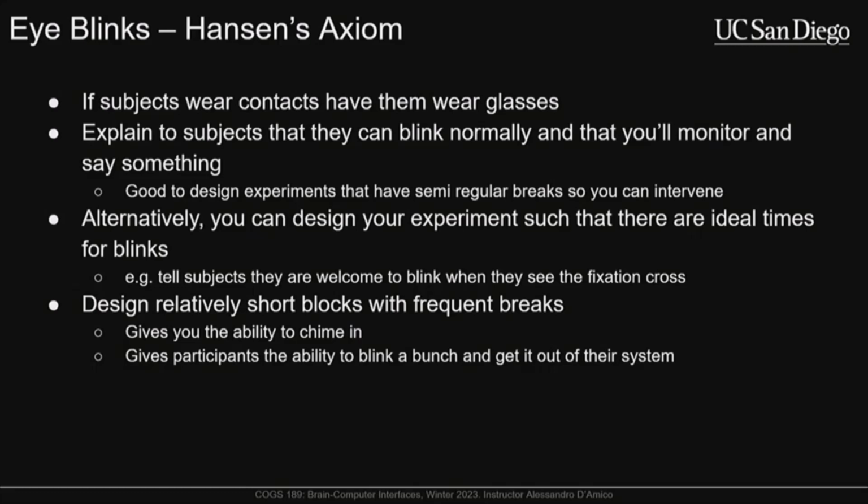That is the biggest reason, but also sometimes I'm just paranoid that there's some kind of metal in them or something that would be problematic with recording. Yeah, I think the metal is less of a problem, but most glasses are plastic nowadays anyway. But yeah, that's the logic that Luck provides, and I'm inclined to, I don't tell my participants either way. I just say, okay, if you wear contacts or glasses, wear contacts or glasses, because in general, these participants do tend to blink more anyway. That's something that you notice as well when you're recording from people wearing glasses and contacts.